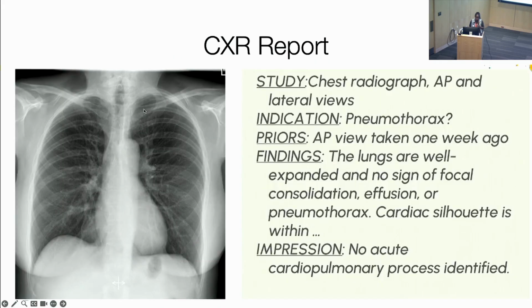So here's a radiology report, right? Every picture should have a report. There are parts of a report. One of them is the study that describes the study name. So you remember, DICOM metadata is very, very dirty. You have to verify it. This has been a painful lesson for us, including some of the tricks that we've used for the chest x-rays, is to even look at the number of images in a jacket, number of instances, right? In a patient jacket, right? So you can think about it like a folder. And if you find, well, this chest x-ray data set per patient has like 10 images in the same day, something is wrong, right? So just doing something like that.